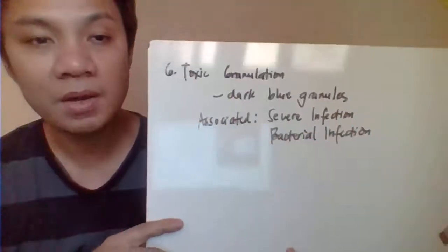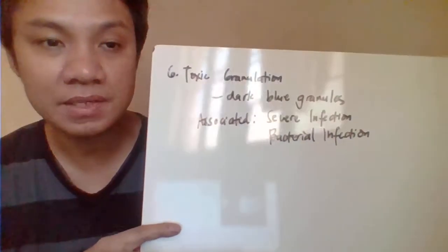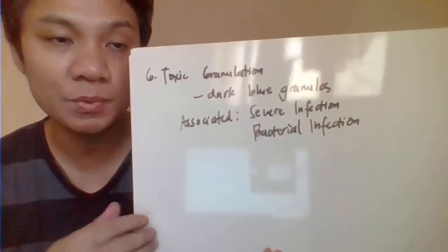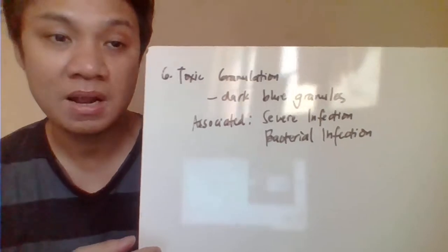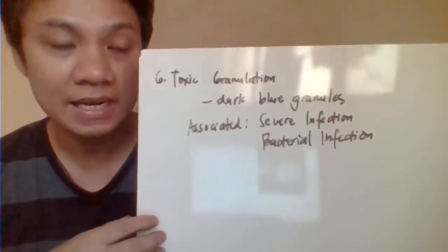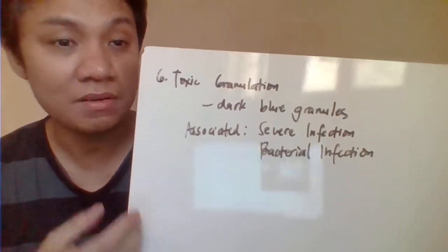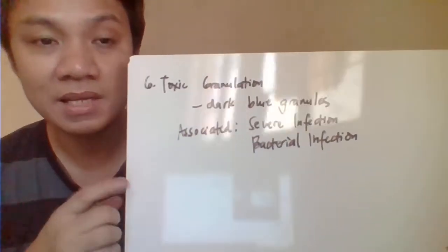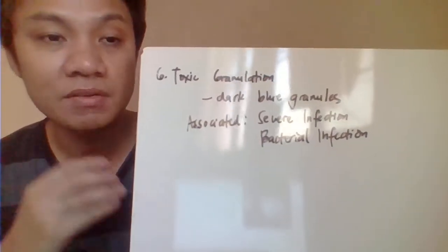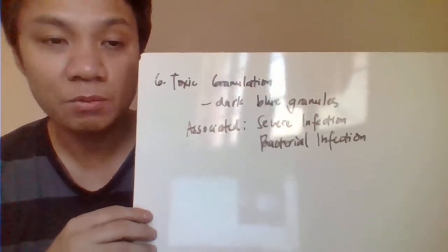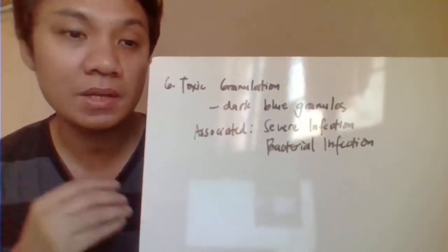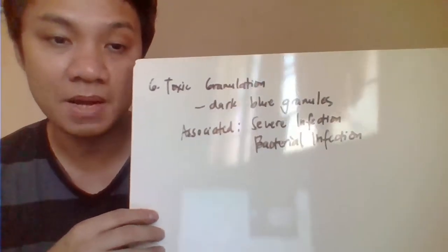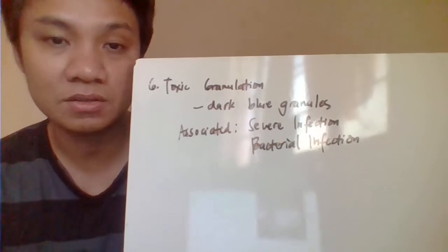Another anomaly is toxic granulation, characterized by dark blue granules which resemble the Alder-Reilly anomaly in terms of morphology. But in this case, toxic granulation shows very prominent granules that are associated with severe infection or bacterial infection.